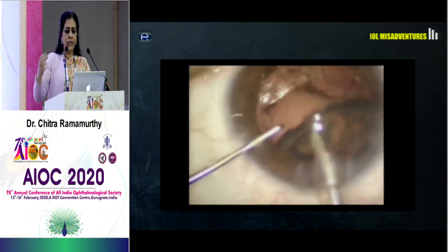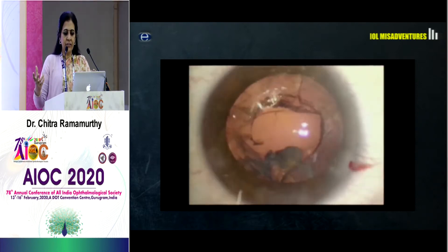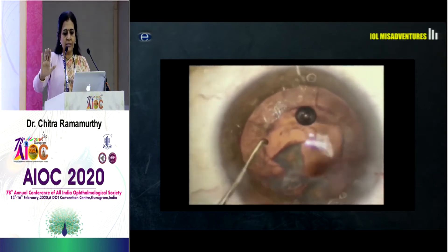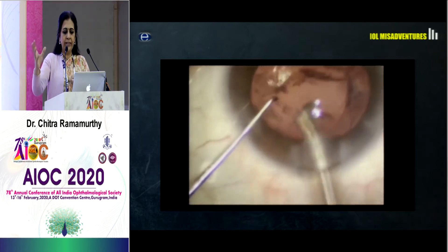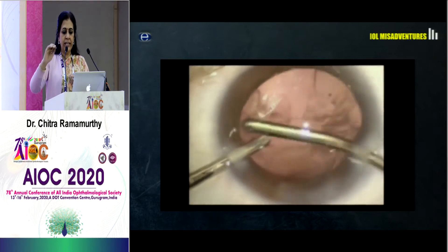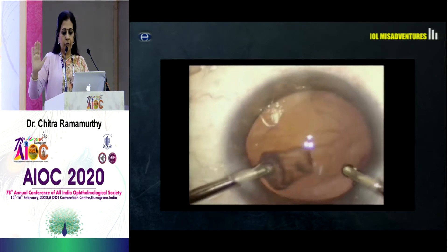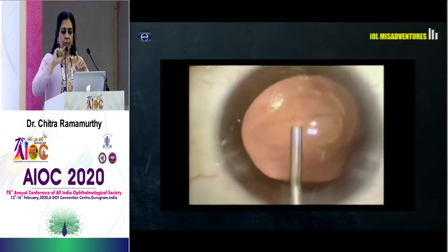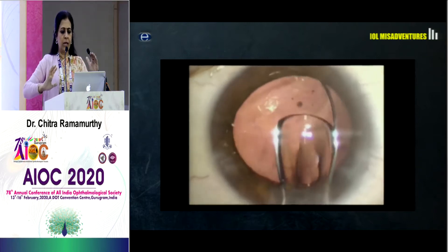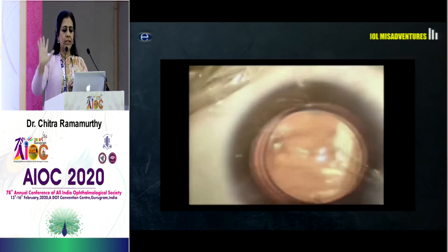I am rotating the nucleus — again it's easy — but then see, there is a PCR sitting there. There is some vitreous traction so I remove the phaco probe, inject viscoelastic to plug the vitreous from coming forward. Some of it is already there, but I feel like taking off the tiny bits of epinucleus, then do a good vitrectomy. The ease with which I am able to remove the cortex is a clear indicator that the vitrectomy is good. There is a horizontal wrap-around PCR but there is enough PC support above and below.